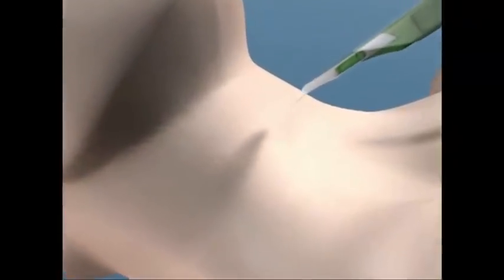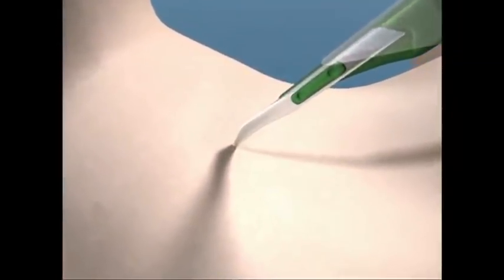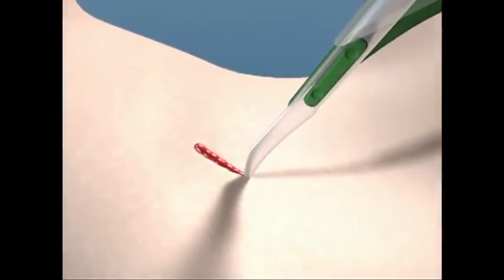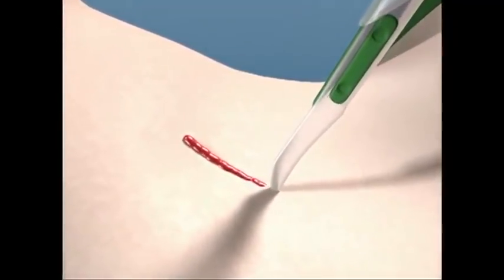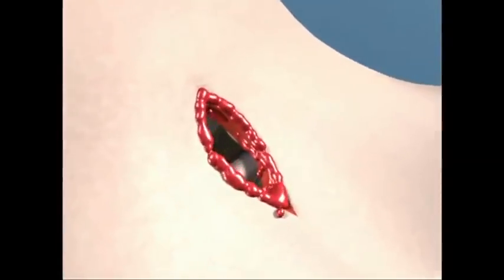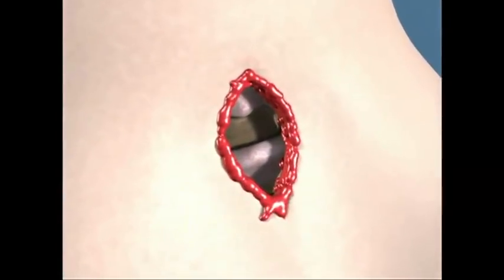Using a scalpel, make a vertical incision through the skin large enough to accommodate the Shiley tube over the cricothyroid membrane. If necessary, spread the soft tissues to better visualize the cricothyroid membrane.